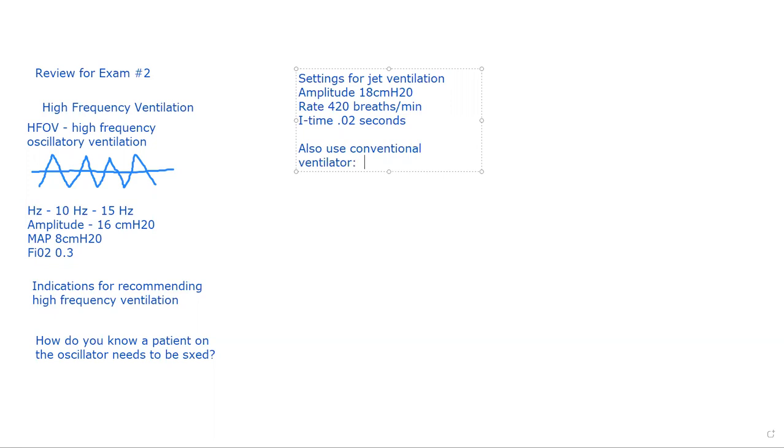And the conventional ventilator provides FiO2, PEEP, and some SIMV breaths. And the purpose of the SIMV breaths, they act like a sigh.